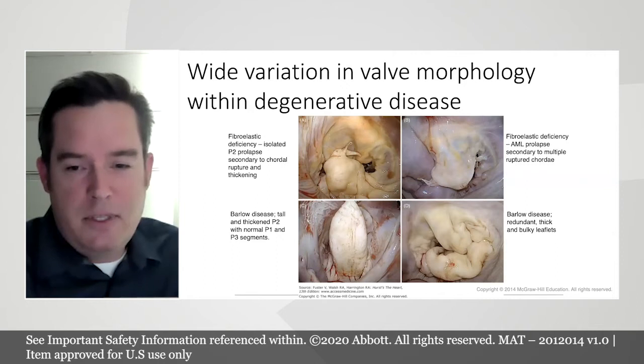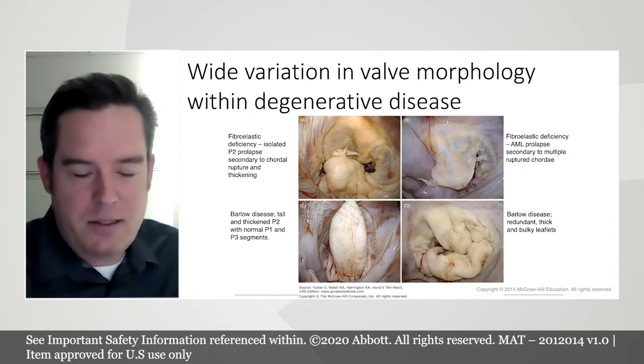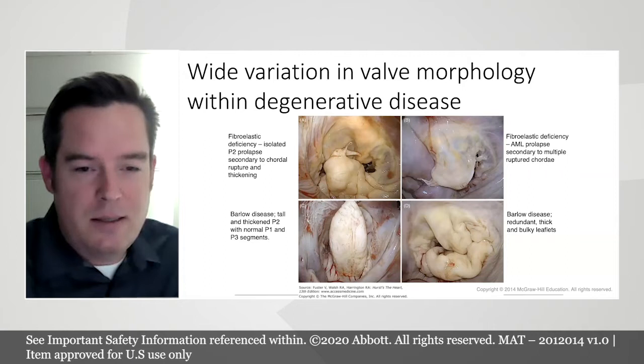And I love this slide just because it shows you what you're up against for some of these patients. These are certainly some extreme cases, but the gradation or the diversity of valves that you may come across for each of these patients, and the approach to them, is very, very different. Sometimes they look a lot more simple on the screen, on the TE probe, but surgically they can be very, very complicated.